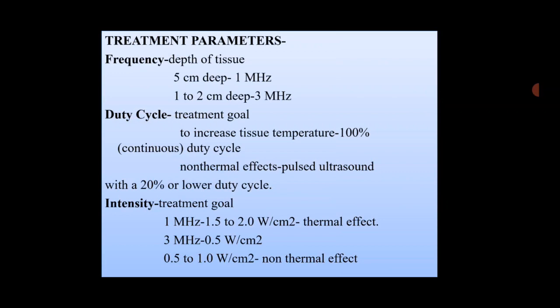Whenever you are giving the ultrasound to have the thermal effect, the patient should feel the heat after 2 to 3 minutes of application. If the patient is not getting the heat, that means the parameters which you have selected are wrong. And there should not be any other complications like burning.